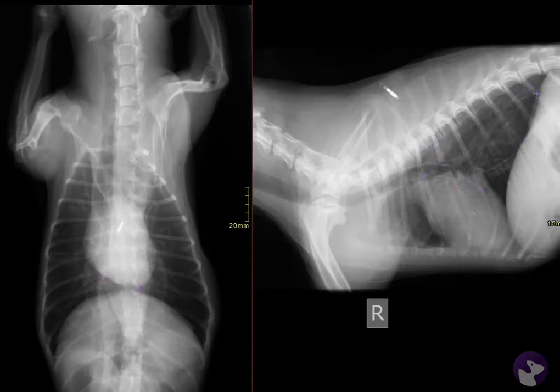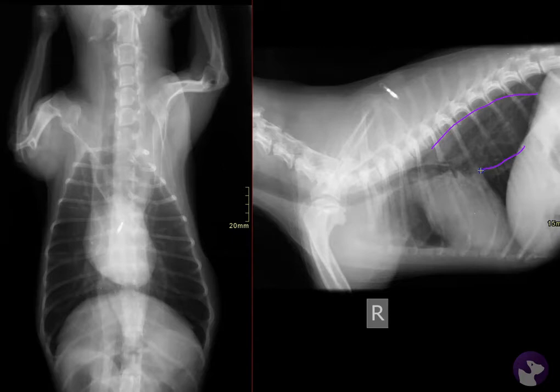That last line I drew probably didn't encompass the entire esophagus, so it's partially superimposed with the aorta there. But this ventral margin becomes really easy to identify because there's actually gas on either side of it. Those are important features to look for when we're trying to find evidence of megaesophagus.